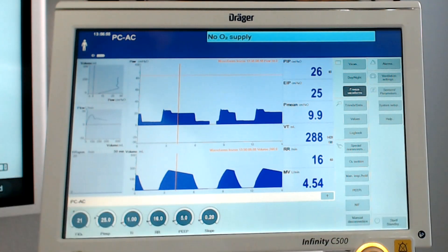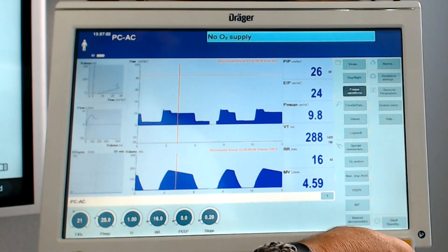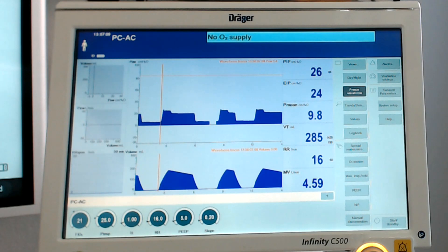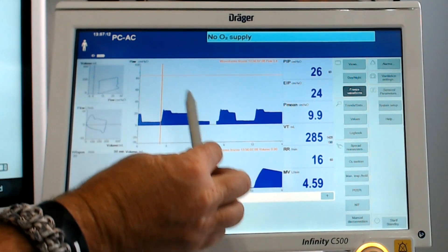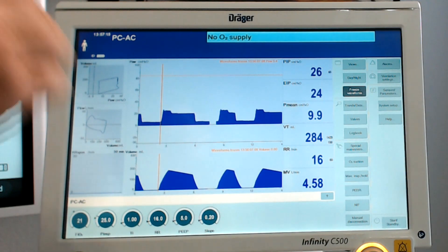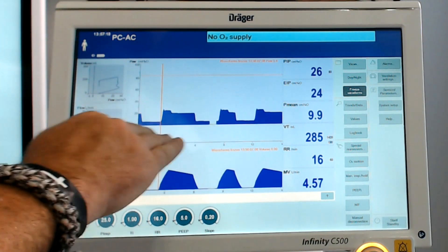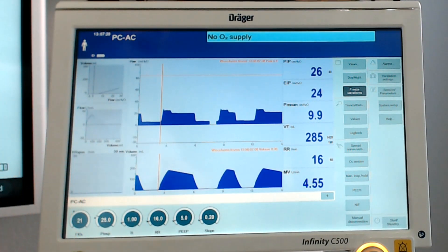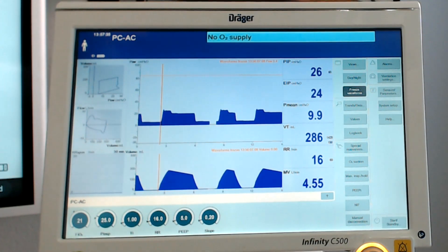Maybe there is a drop in pressure control with airway resistance - I'll look further into this. What I do notice is that if you think back to the volume control video, there was a big drop from peak inspiratory pressure to plateau. We didn't get that big of a significant drop here. We see a slight drop, but not nearly as big as in volume control. In pressure control, you're not going to allow that pressure to go as high as in volume control. So that's pressure control - baseline, decreased compliance, increased compliance, and increasing airway resistance.